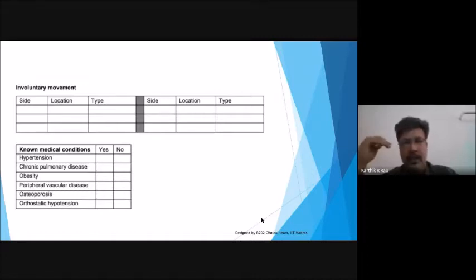So these are not absolute contraindications. When we talk about contraindications, these are terms we use like, this person should not be using the wheelchair. It is not like that. Some of them, yes, but not all of them. So then we would like to know whether this person is able to do it. Even if you just buy a wheelchair and take it home and you're all fit, and then you stand on it for 1 hour, the person may have some negative issues, because they're not used to standing for such a long period of time. So all of this has to be considered.